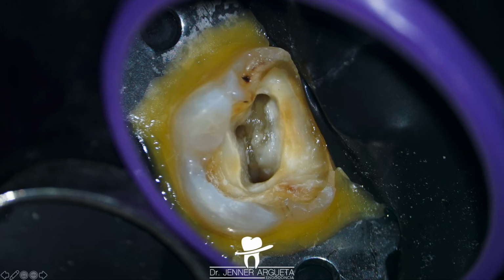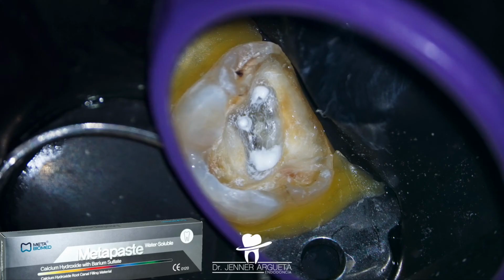Now that we were able to locate the main canals, we were able to locate the possible location of the MB2. We proceed to medicate the canals, placing some calcium hydroxide. We like to use Meta paste. Meta paste will help us to protect the entrances of the root canal. It will work as a physical barrier, and it will work as an intracanal medication, because this is the point in which we need to perform our pre-endodontic core build-up.